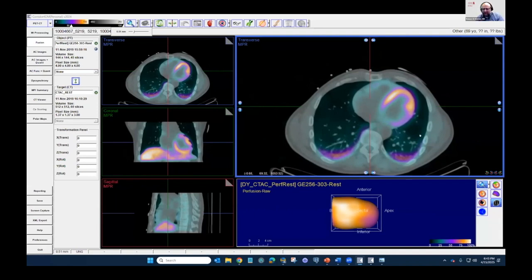All right, so thanks, Rob and James. I think these are all very important points, and while this is important for any hybrid imaging, any PET imaging, this is going to become an important issue for flurpiridaz given its resolution. So our techs need to give us good images.